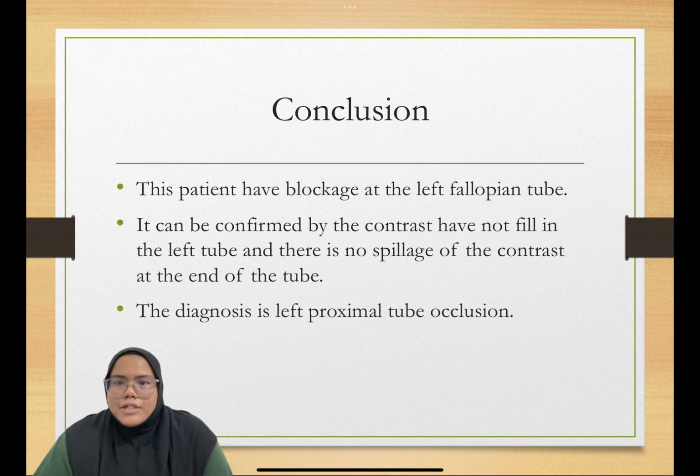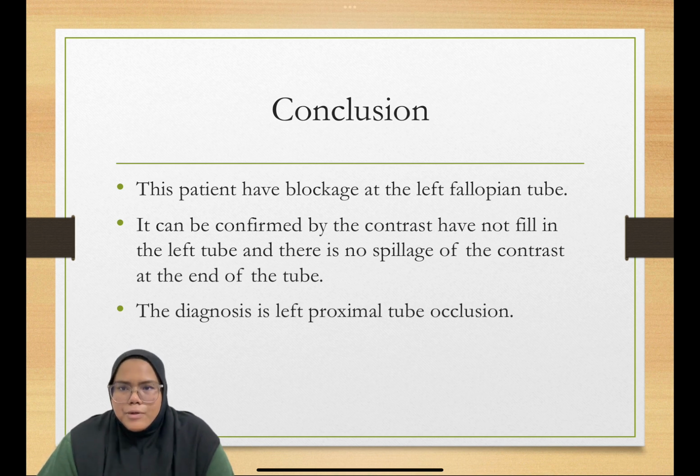In conclusion, we can see that this patient has a blockage at the left fallopian tube. It can be confirmed by the contrast not filling the left tube and there being no spillage of the contrast at the end of the tube. The diagnosis is left proximal tube occlusion.